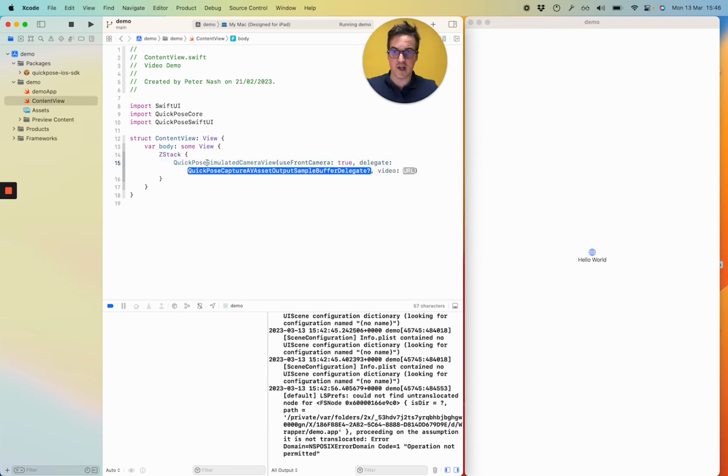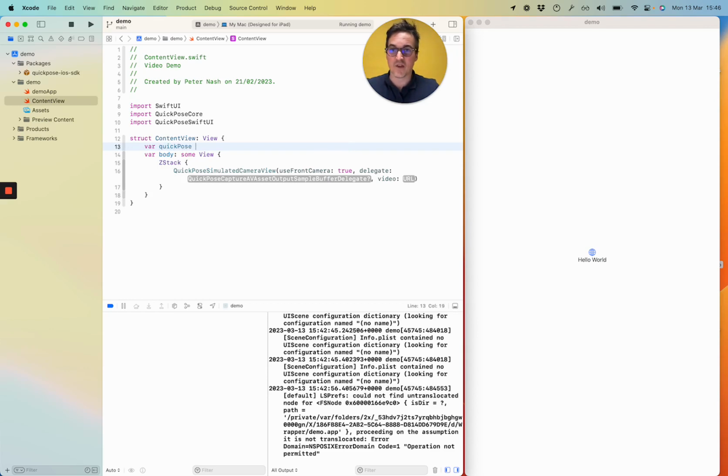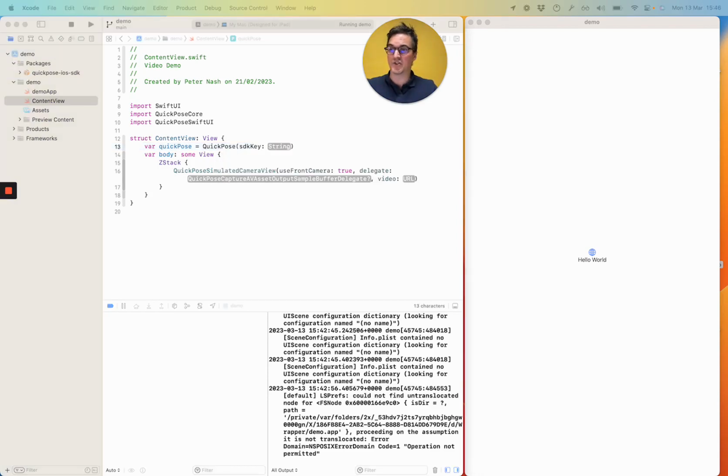It wants a QuickPose delegate. That's a long-winded way of saying QuickPose. So I'm just going to bring in QuickPose here. QuickPose. We need an SDK key. The SDK key is tied to your bundle ID, so make sure you register on our dev portal. It is free. Okay, so we've got our QuickPose implementation there.